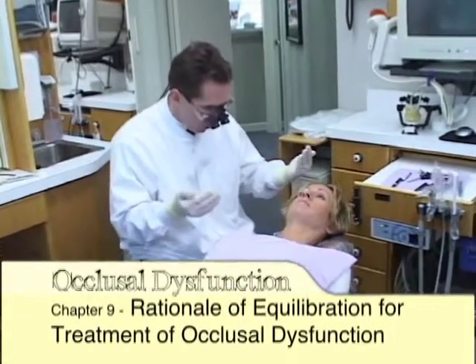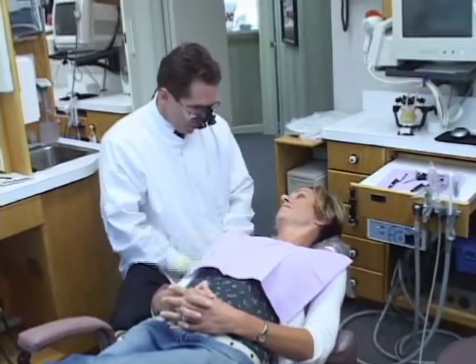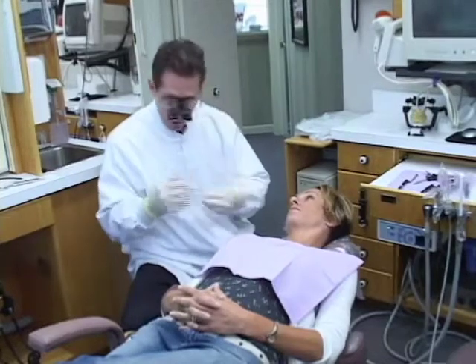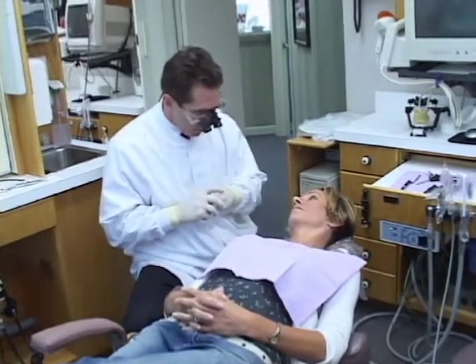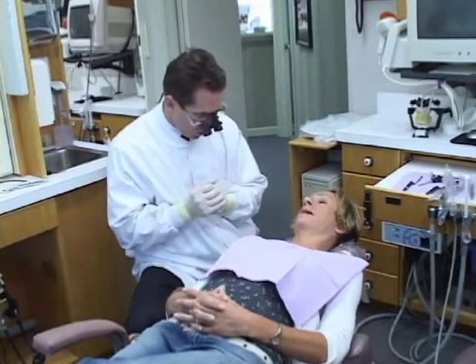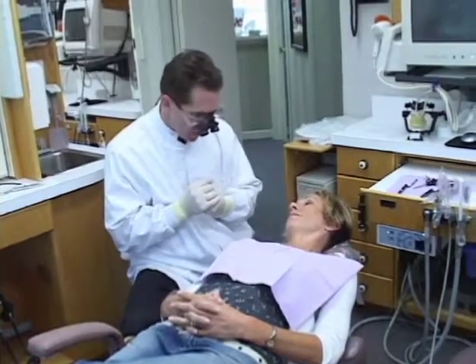Debbie has decided that she would like to proceed with the equilibration. And again, I'll say this again and again — reviewing what are our reasonable expectations or what is the rationale for doing that. Number one, I think the amount of equilibration is very minimal. So the actual treatment, the invasiveness of it, is very minimal.